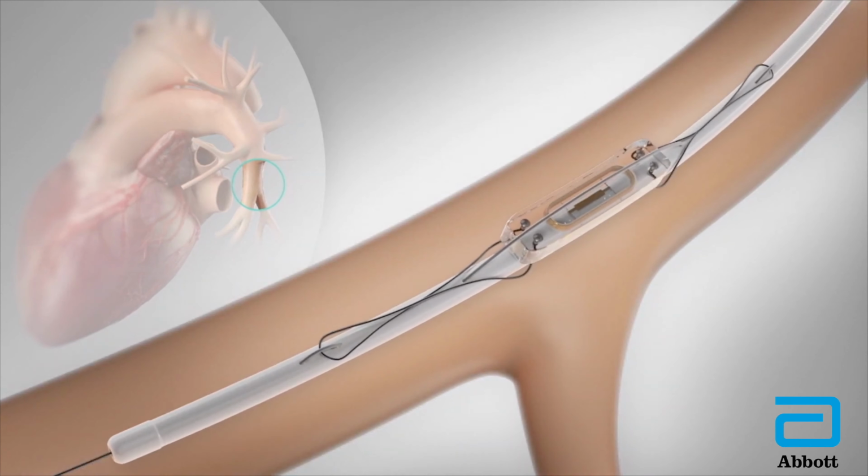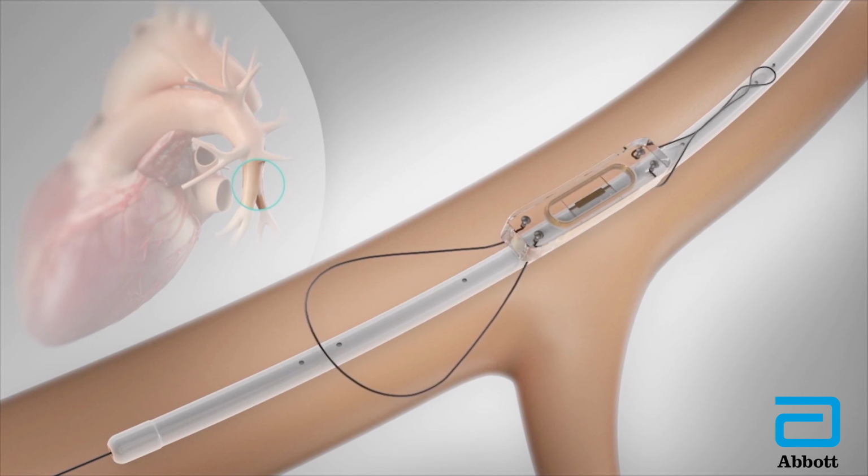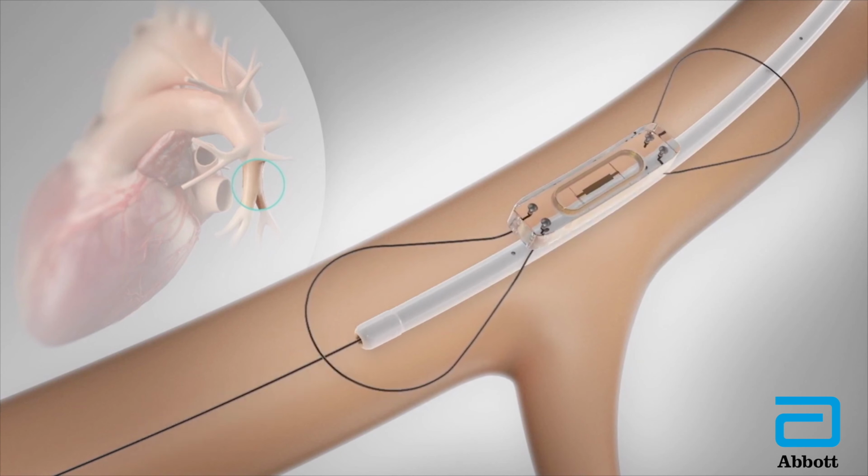Once the device is implanted and calibrated, you do go through a little bit of an orientation process with the manufacturer to make sure that you understand the pillow and how to set it up. You do have to be on antiplatelets or medications like aspirin or clopidogrel for a certain period of time, but you go home the same day. Just some restrictions to avoid any bleeding at the access site.